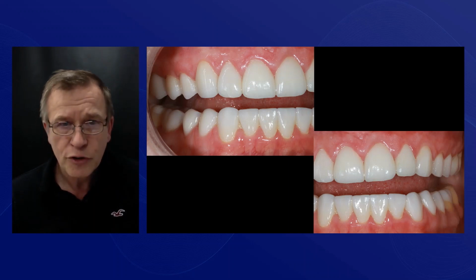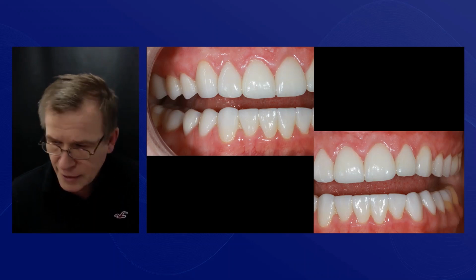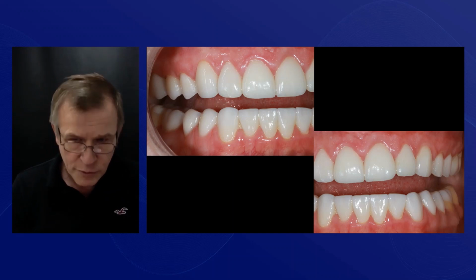Here we have just still got provisionals on the upper anteriors where that crown lengthening was in place. And here she is before, and there she is afterwards with everything in place. Everything was done digitally, never left the computer screen. Makes life so much easier.